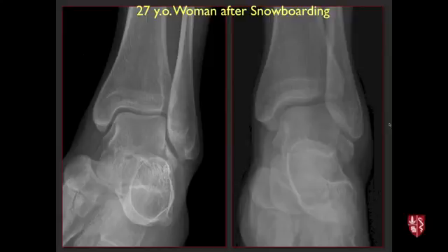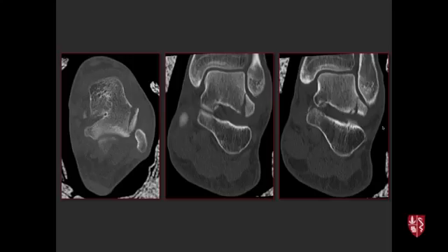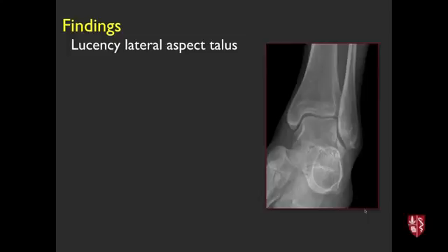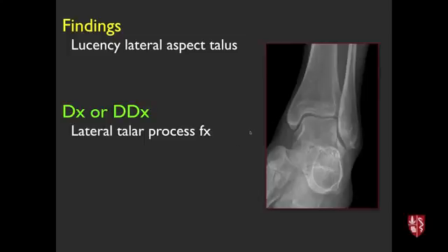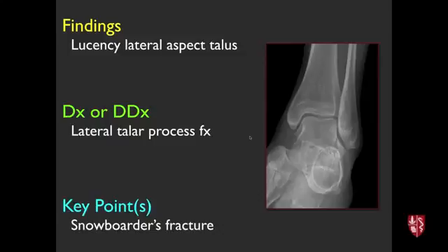Next case, young woman with a snowboarding injury. Radiographs of the ankle may show a subtle lucency; CT confirms a definite lucency at the lateral aspect of the talus involving the lateral talar process — a so-called snowboarder's fracture. This injury is associated with snowboarding and similar activities. It can be easy to miss on plain film, so awareness of this injury pattern is important.